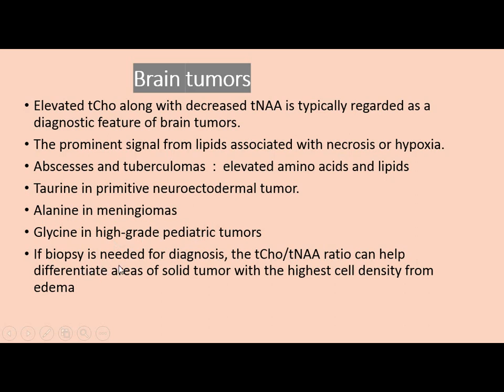And if biopsy is needed for diagnosis, of course you want to take the biopsy from the area of highest cell density, and you will put the spectrum over the area with the highest choline and NAA ratio, which will be the site for the biopsy.